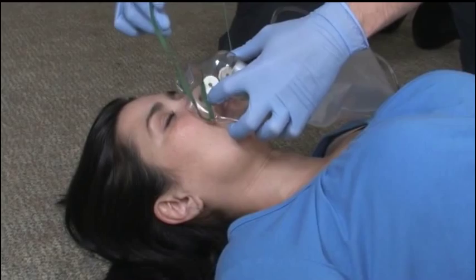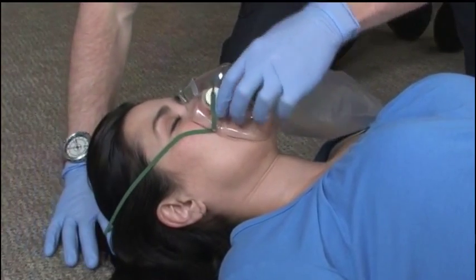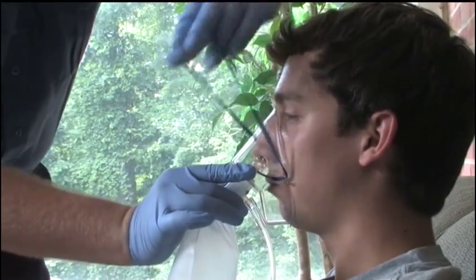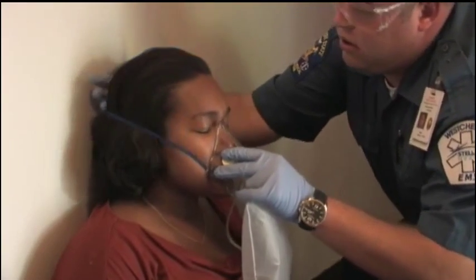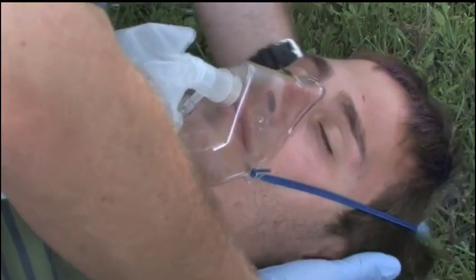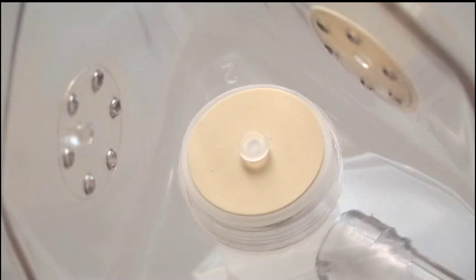A non-rebreather mask provides the highest concentration of supplemental oxygen delivered in EMS. This mask is indicated for patients who exhibit any of the following signs or symptoms: cyanosis, cool clammy skin, shortness of breath, chest pain, severe injuries, altered mental status, or a pulse oximetry reading below 90%. The device delivers oxygen by an attached reservoir bag connected to the mask with a one-way valve.